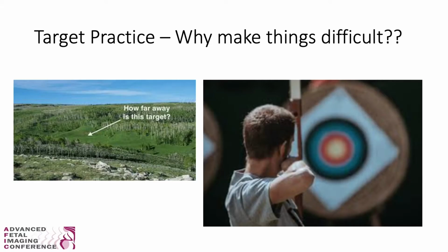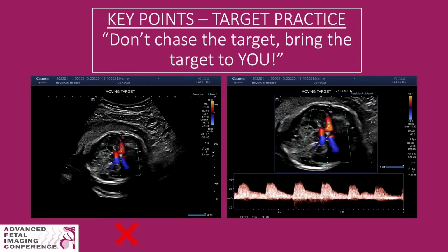Next, I want to talk to you a little bit about target practice and why we continually make things more difficult for ourselves by shooting for a target that is so far away rather than bringing it close to us. What I want to stress to all of you is don't chase the target. Bring the target to you.